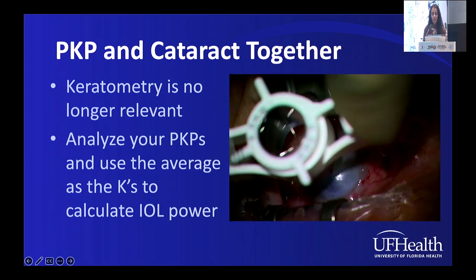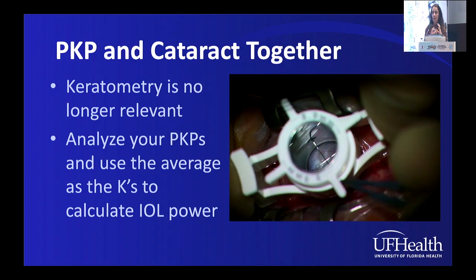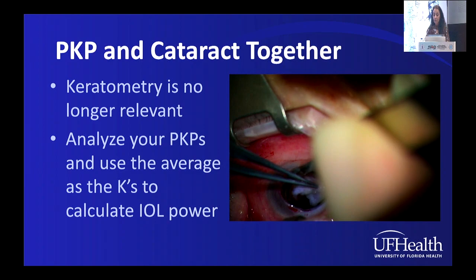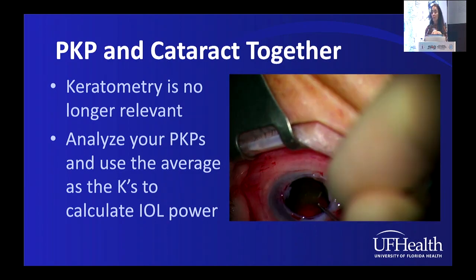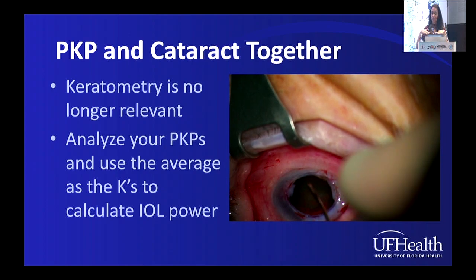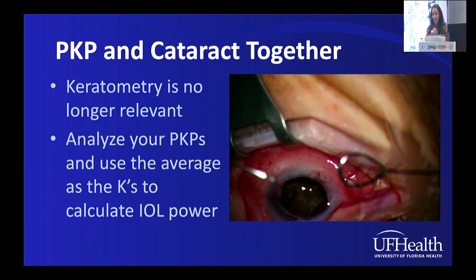And so, when you do these surgeries, suture removal becomes very critical afterwards. Now, this patient, obviously, coming from a long distance, we don't know what to expect in there. So we're planning to do a triple so that they don't have to have another surgery. My fellow is trying to do a capsulorhexis, but remember, again, with these patients, you don't have a flat anterior chamber or flat anterior capsule, and so they tend to run out. So he did run out, and you can always switch to a can opener.